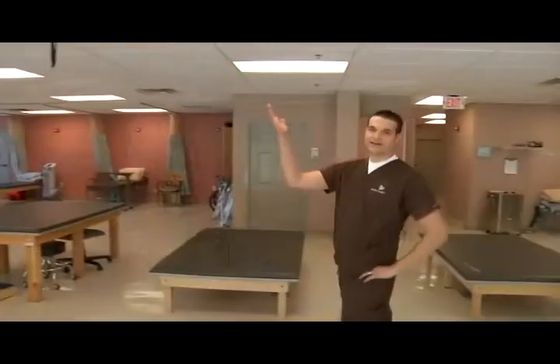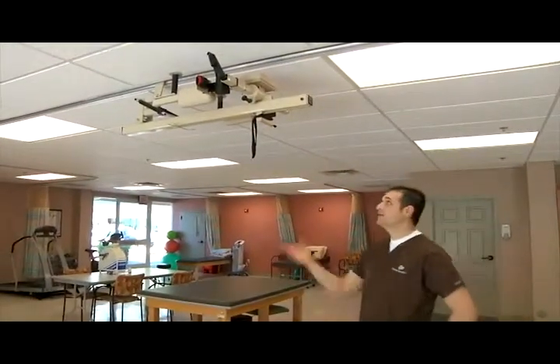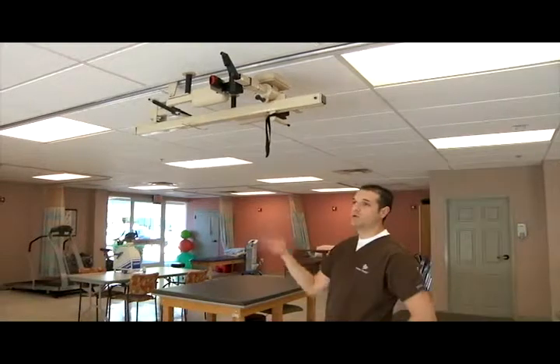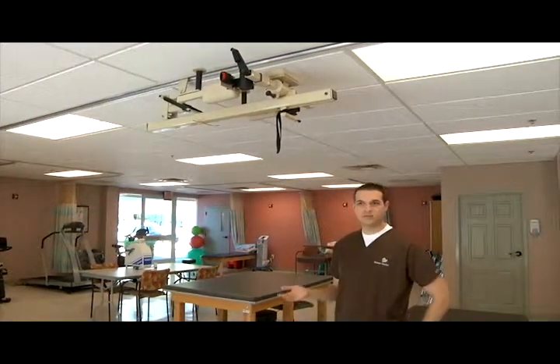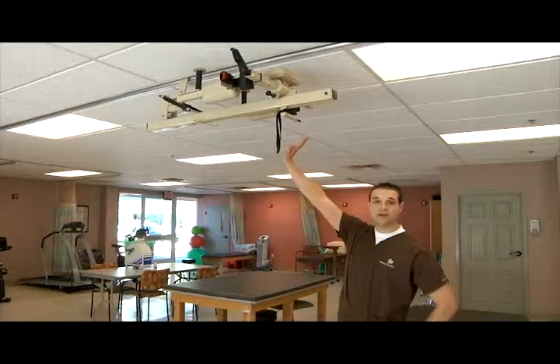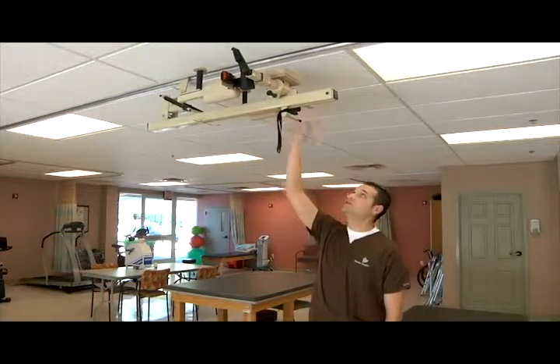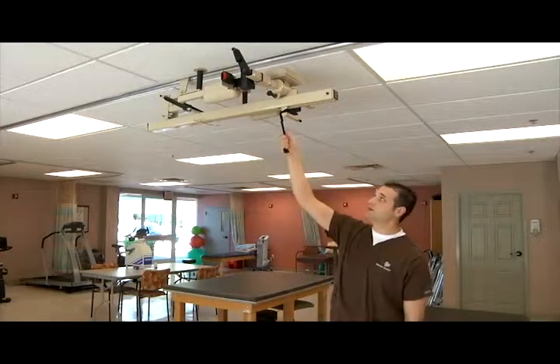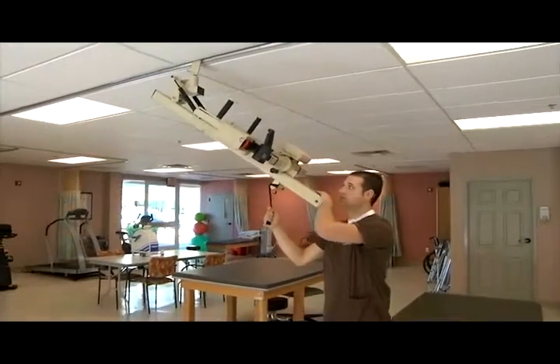This is the SecureTrack here, okay? We're going to be using this to ambulate some of our patients. It makes the ambulation a bit easier, helps them put weight through their legs. It's going to challenge their balance a little bit so we can get them off the walker sooner. It's also conveniently stored here in the ceiling for our use for when we need it, okay? So what we're going to do is go ahead and pull the machine down. We're going to be using the strap here to do that, and we're going to do that until it clasps into place.